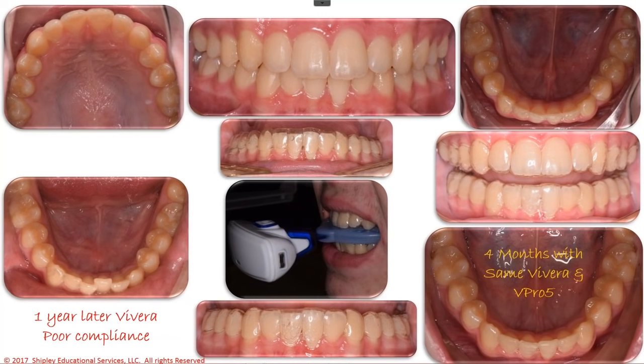That is essentially what he would have had to pay for a new retainer anyway, much, much less than he would have had to pay with refinement. And here we won future referrals rather than lost referrals on this patient. So an interesting way to use the V-Pro 5 post-treatment.